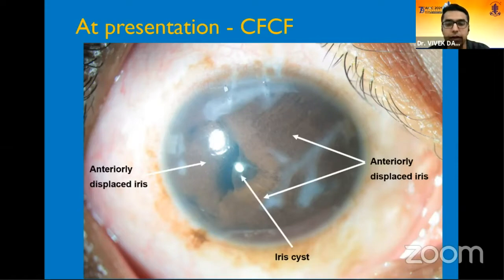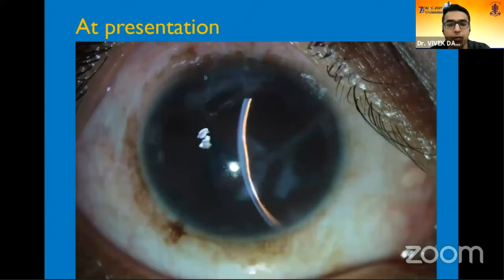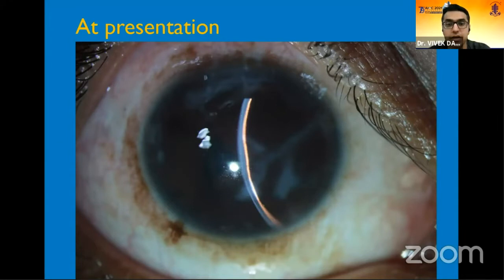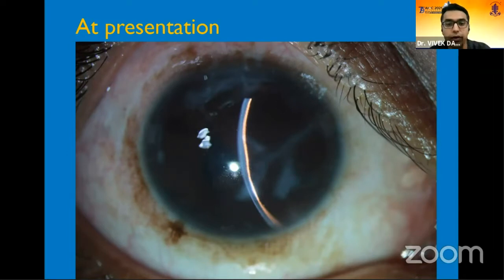There were multiple areas of haze due to localized endothelial decompensation. Looking at the slit lamp photograph in slit illumination, this gives us a good idea of the approximation and opposition of the iris surface with the corneal endothelium.